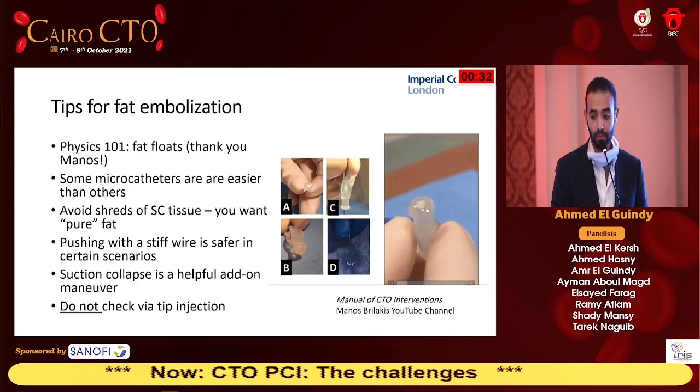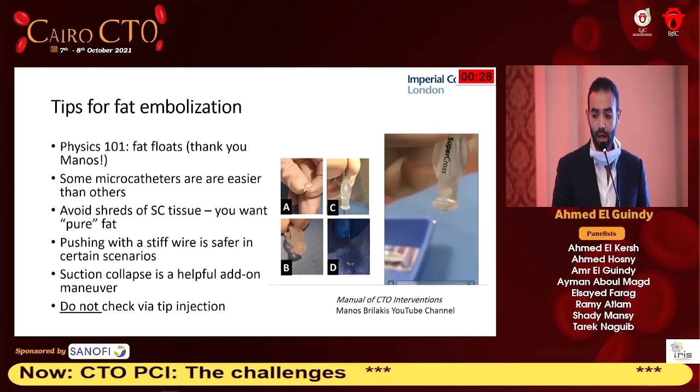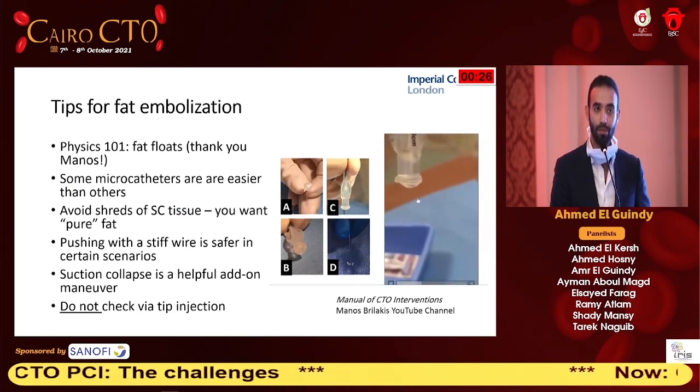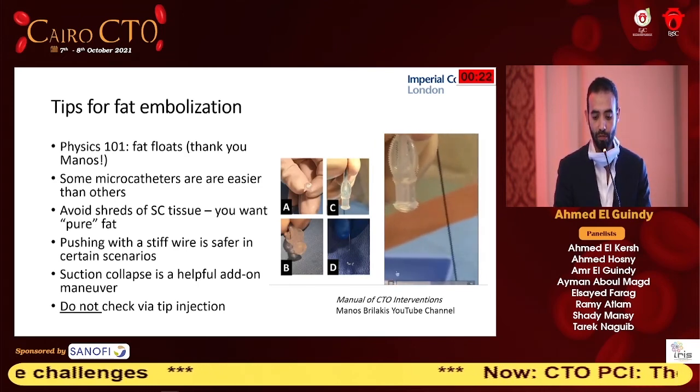This is a video from Manos's YouTube channel. Remember that fat floats. Some microcatheters have their hubs, they're relatively wider, so they're easier to load up fat into.